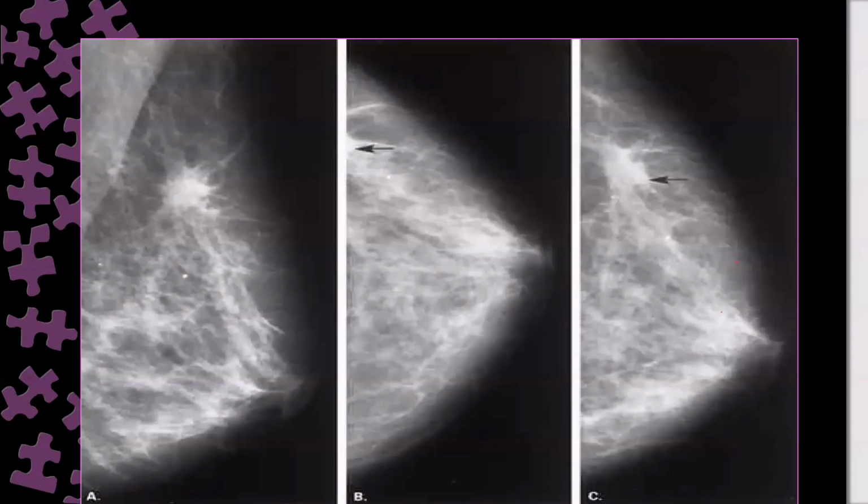You imagine you are in the hospital. Yes. Okay, the CC view. Yeah, because I could see part of the lesion here in the CC view. Okay, that is why I said this is a spiculated mass, because I could visualize it here. But it is not so clearly seen. So from here, I could see part of the lesions.